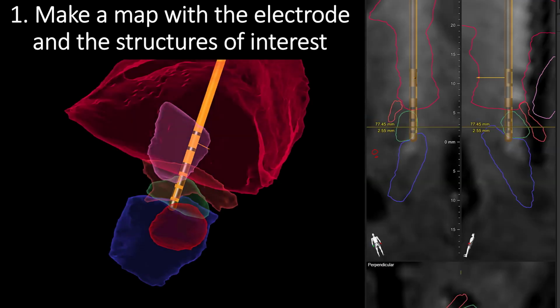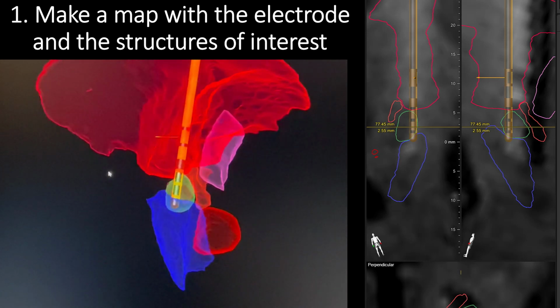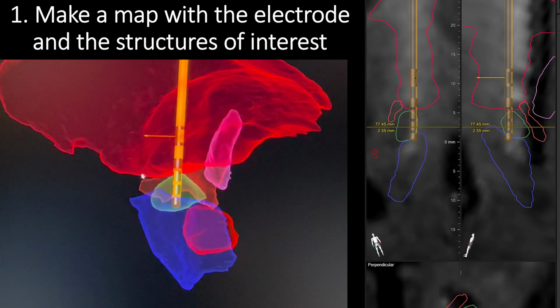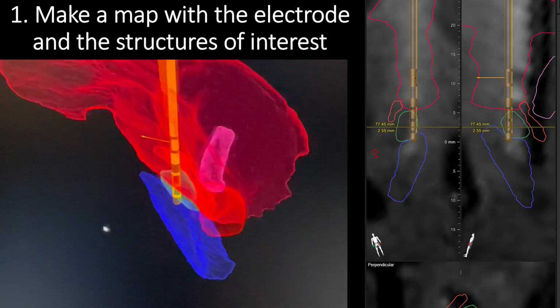So we start the session by making a map or a model with the electrode and the anatomical structures that you find to be of interest, such as your target, the internal capsule, and so on, in order to orientate yourself and to decide on the location of the electrode in relation to the intended target and the approximate area where you would like to place your field of stimulation.